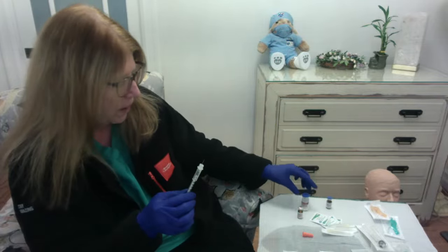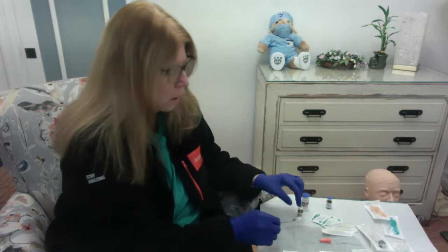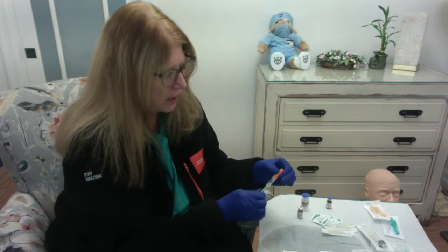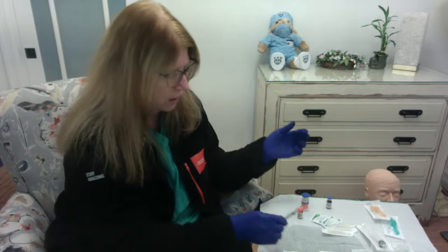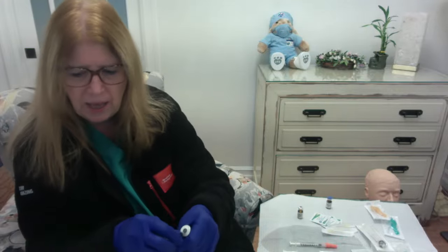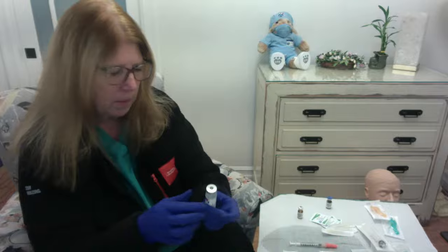So one thing to keep in mind is that once you've put air into the vial once, you can't do it again. It doesn't work multiple times. It only works when the vial is brand new. So let's open up this insulin, again, using your thumb to flip off that cap. And again, the cap is garbage, and we still have that rubber stopper.